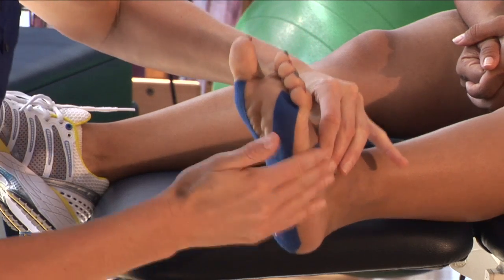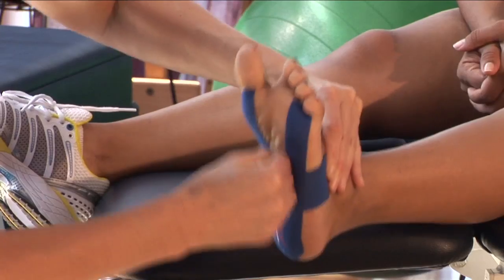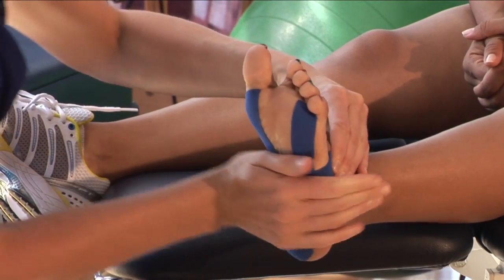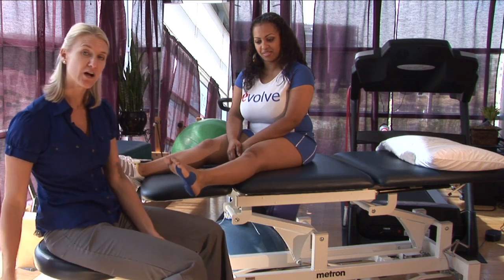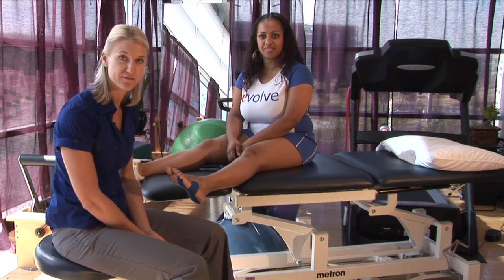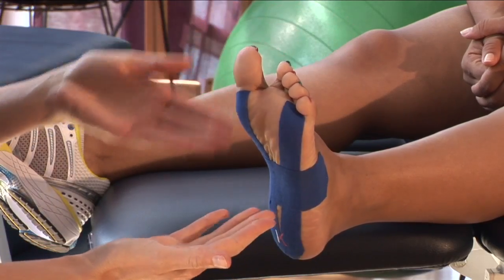Again, no tension on the end, tack it down, and give everything a nice rub so that it sticks. Now that the arch is supported, she can put her sock and shoe on and wear this with any activity that she's going to go do. I'm Tara and this is how to tape the arch for support.